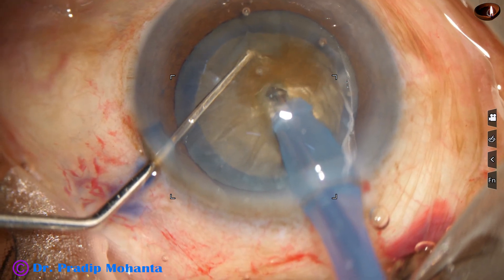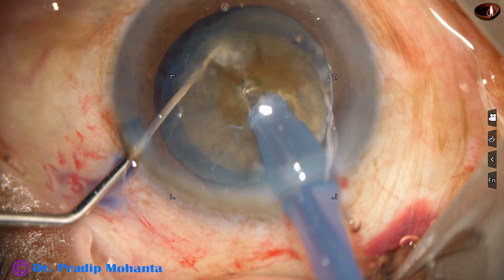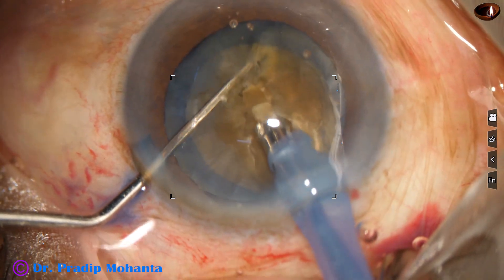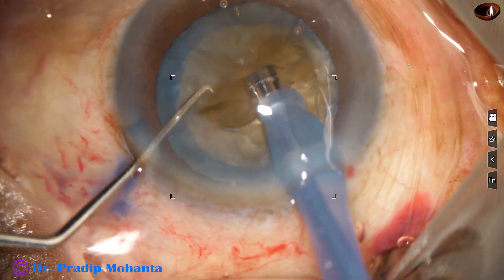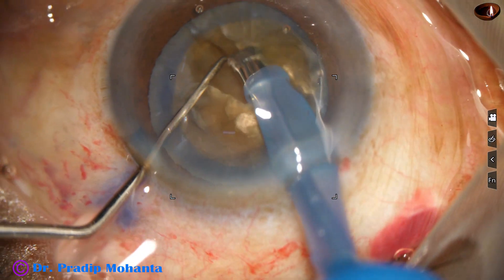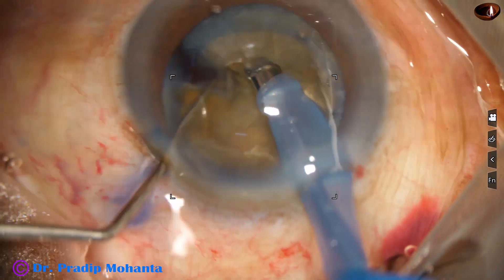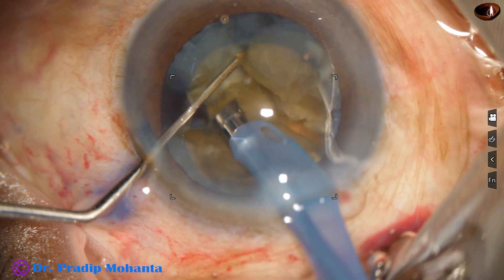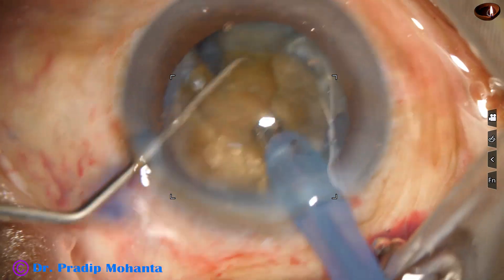Now this is the submarine technique for management of hard cataracts. The tip goes through the substance of the nucleus and we use the chopper to crack the nucleus. With a 180-degree rotation, the nucleus is divided into two heminuclei.